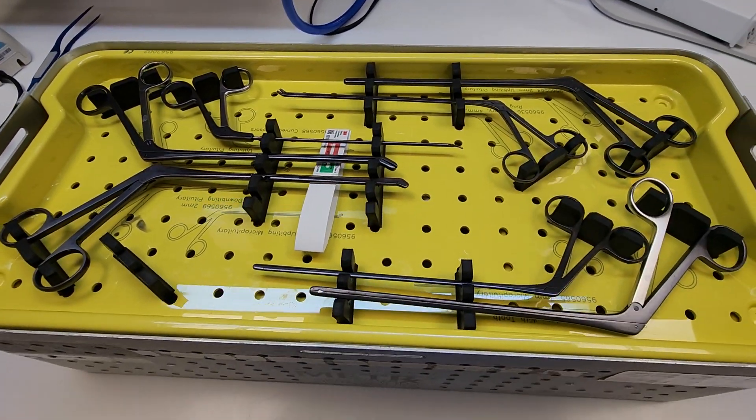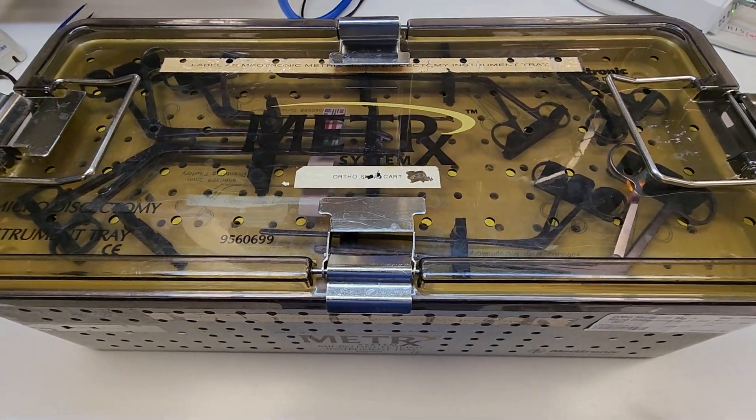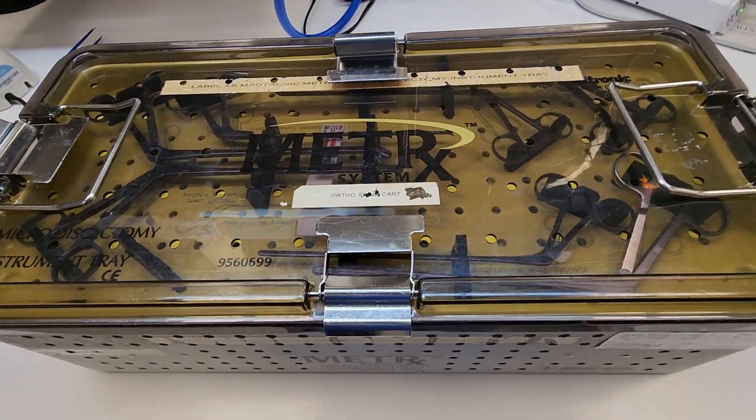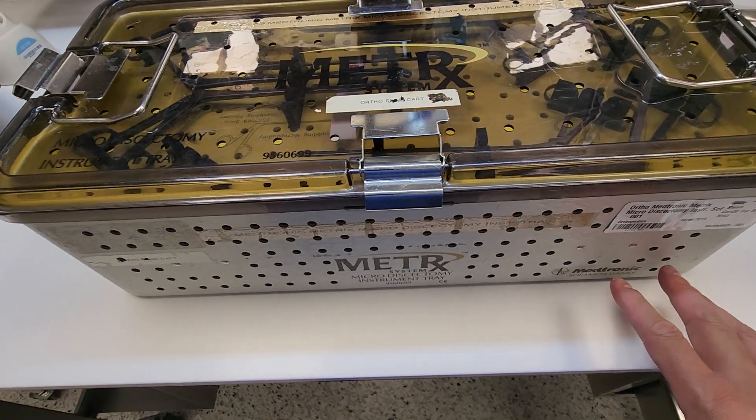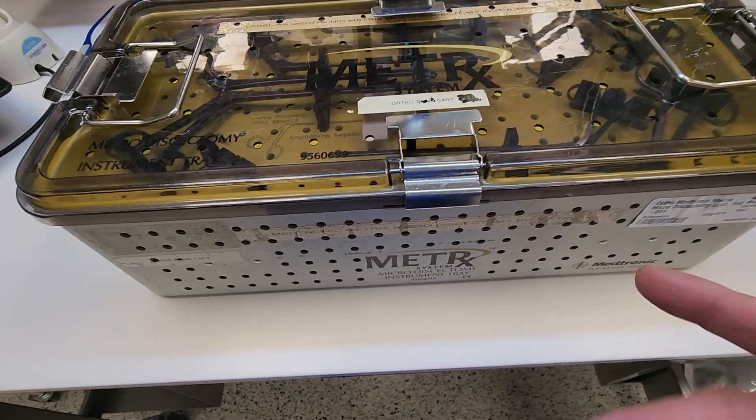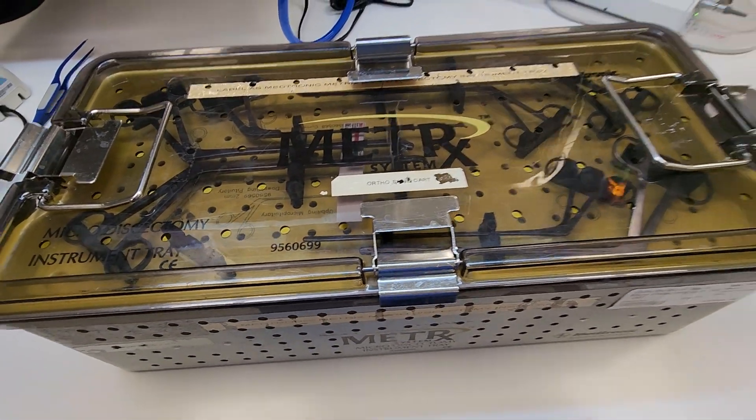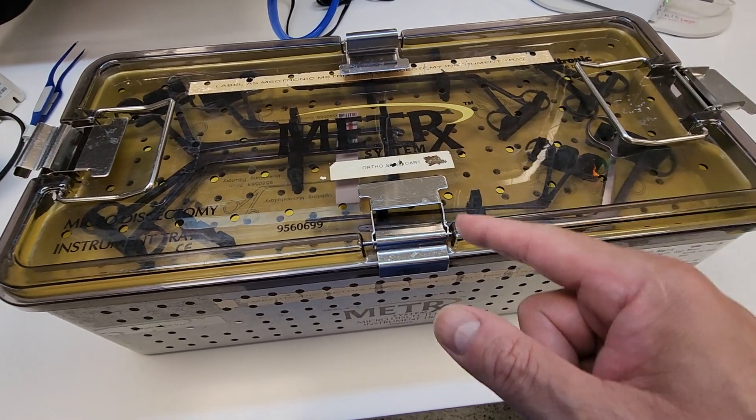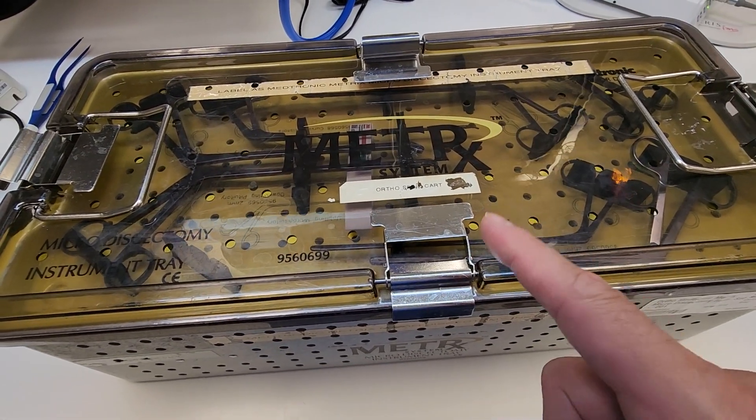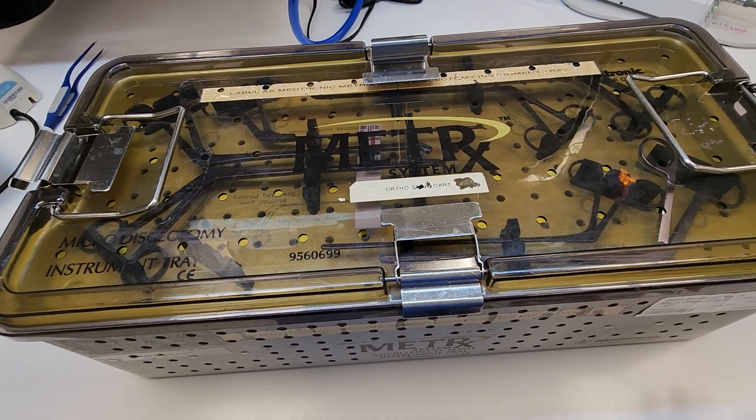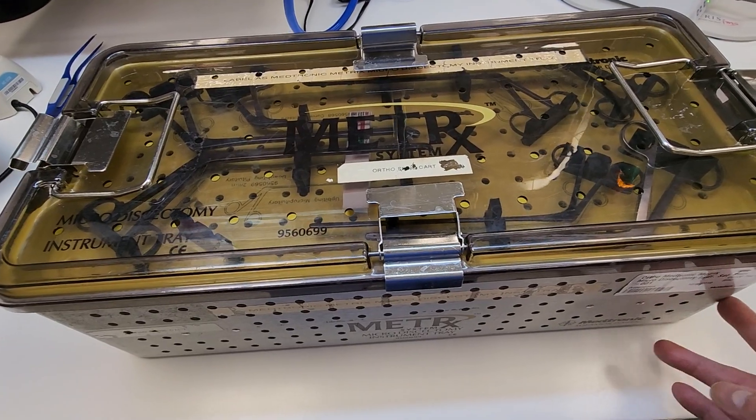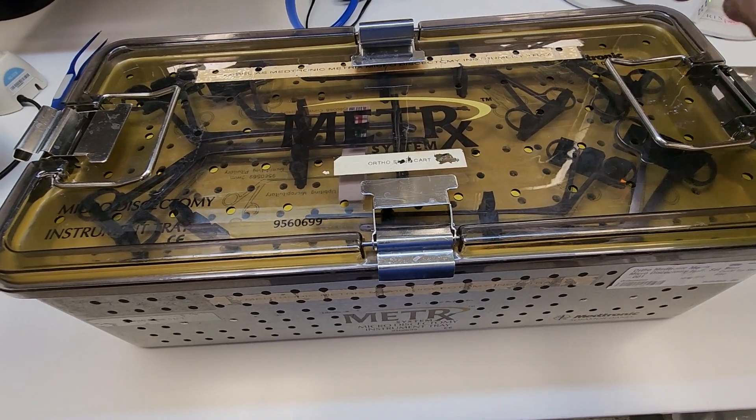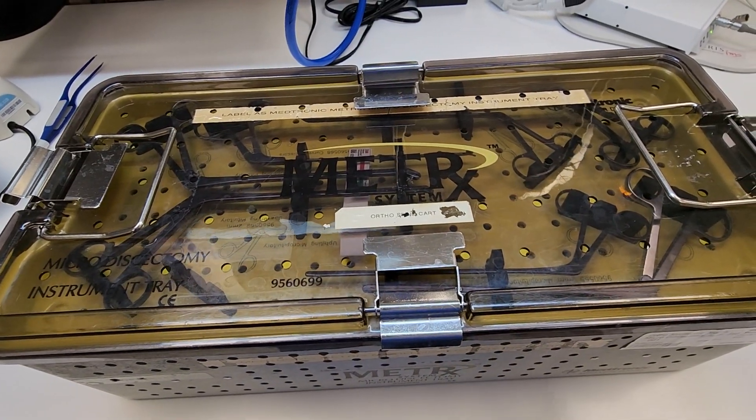But what if we want to do a rigid container and this sterilization container is approved to go into a rigid container because you're trying to convert over to rigid containers? Well, let's follow the IFU for this indicator as well, which states that for a rigid container, for a tray that goes into a rigid container, you should place an indicator on the opposite side, each corner, opposite corners, two on each layer.